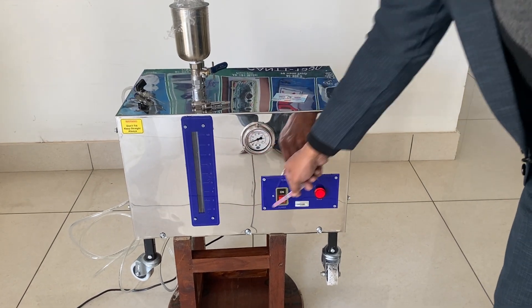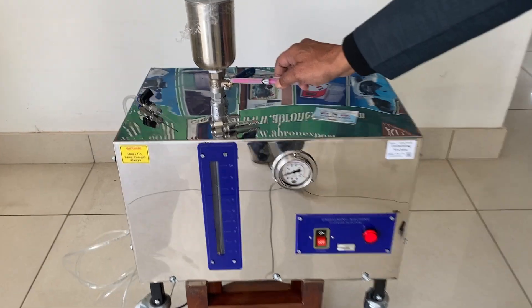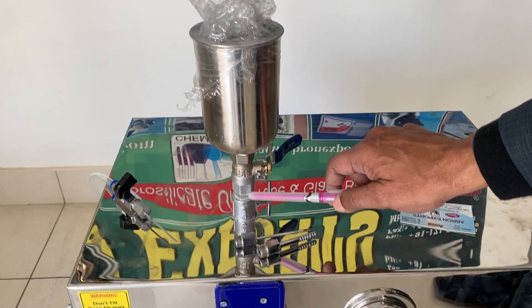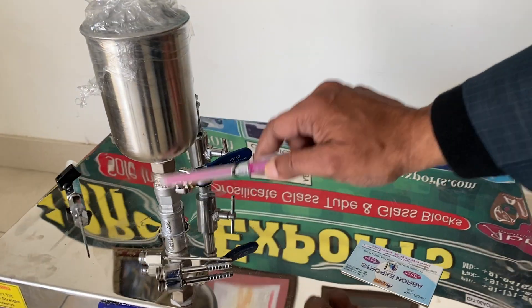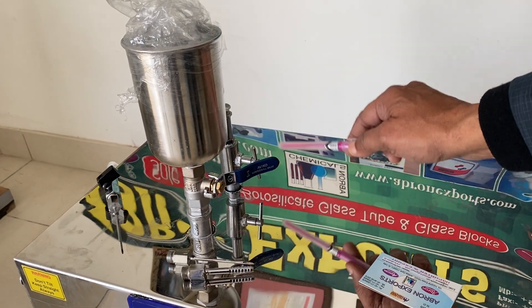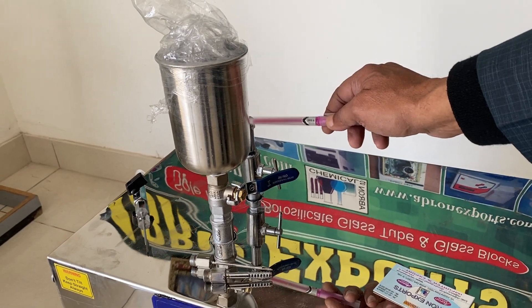There is one chamber here where we put the formalin, by opening this up. When we open this, we can put the formalin solution as per your requirement. While putting the formalin in, when the formalin goes in, air will come out, so it should be opened at that time. There is one safety valve here provided.